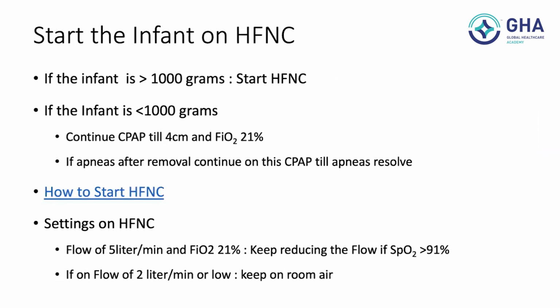So this baby was on a CPAP of 4, FiO2 25%, with no retractions and maintaining good saturation, so the baby was shifted to HFNC. But if the baby is less than 1 kg, maybe the moment you remove CPAP, the baby will go into apneas.